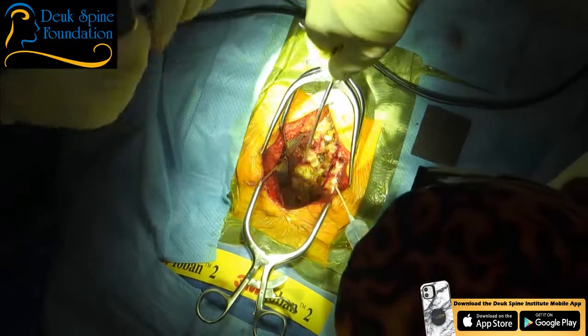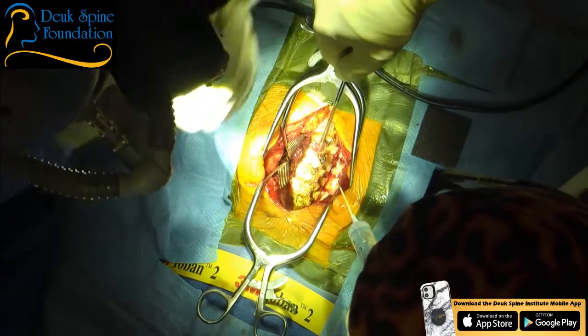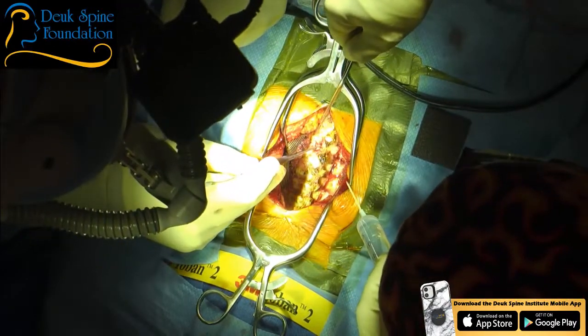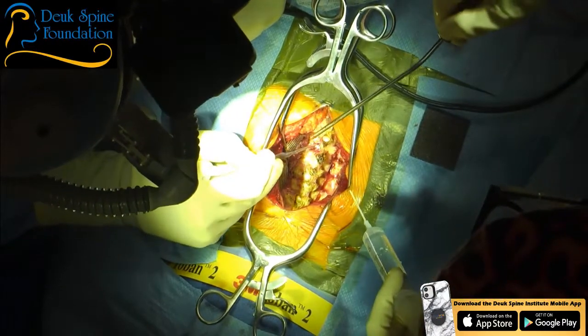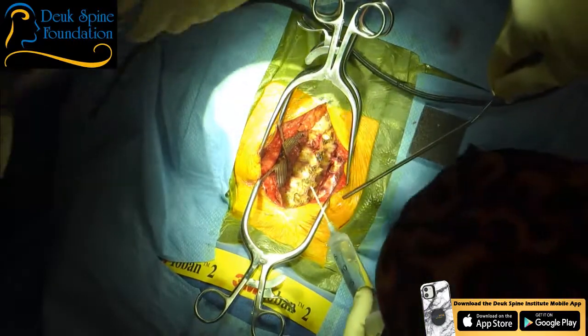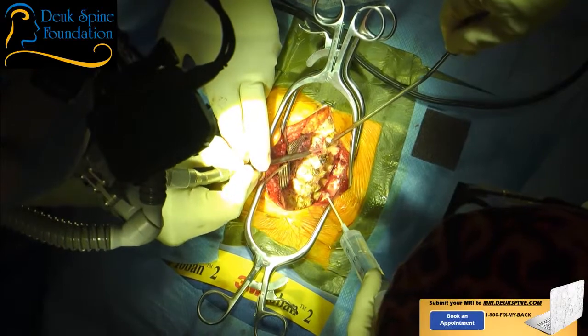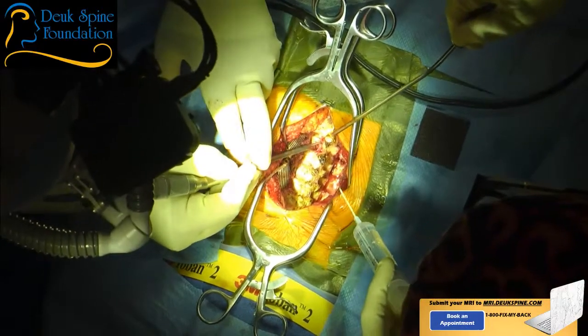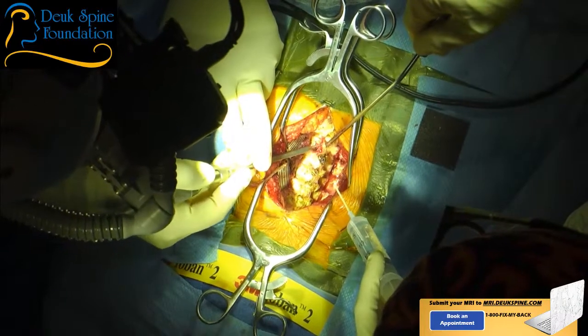All right, we got bone bleeding, diploic bone. I need a little bone wax. So you see that right there? That's classic diploic bone bleeding. All you need is a little bit of bone wax, and that stops it. If you try gel foam, it won't work. If you try bipolaring, it won't work. If you try Bovie, it might work, but you'll be Bovie-ing the spinal cord. I don't recommend that. So the best is bone wax.